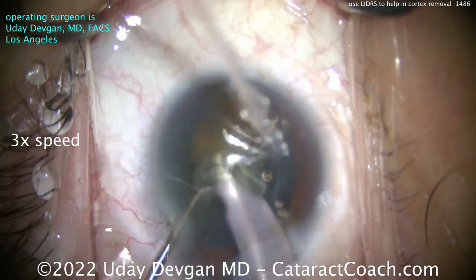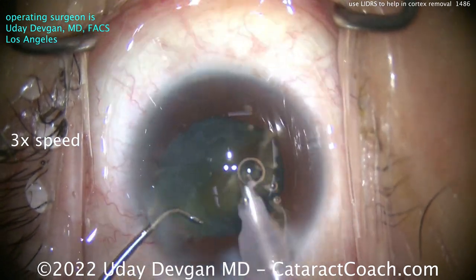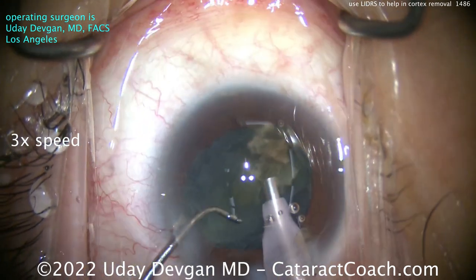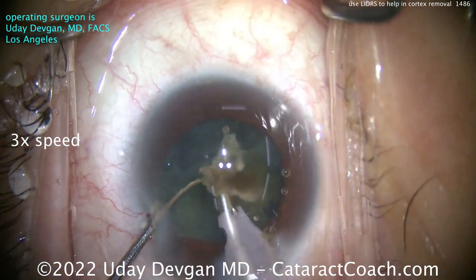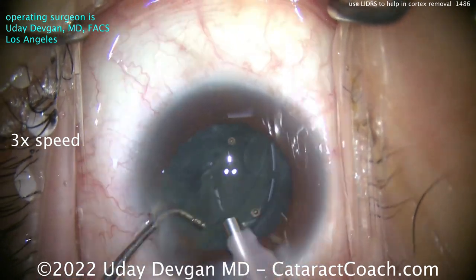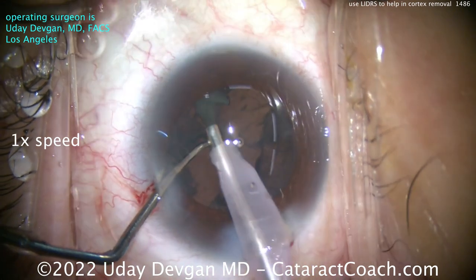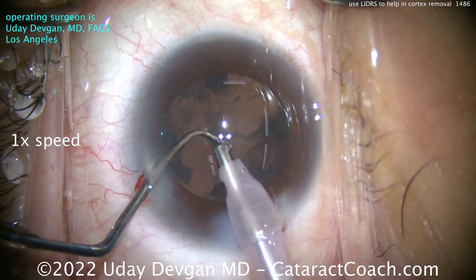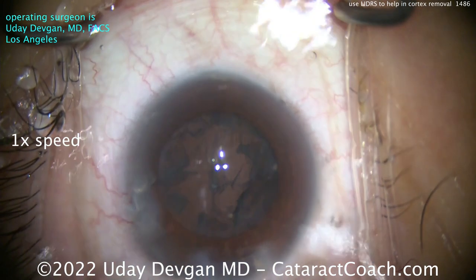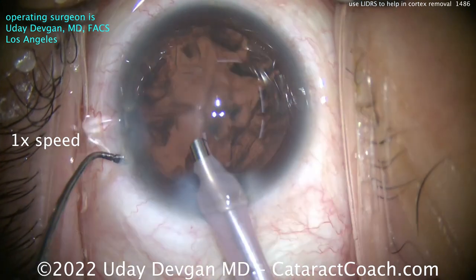Just taking our time, sub-chopping the pieces into smaller fragments, then emulsifying them down — that goes pretty well. This patient does not have the biggest pupil to begin with. After the nucleus is removed and we go for cortex removal, the pupil is on the smaller side and you're not able to see all of the capsule bag. We take out as much as we can of that lens material, the epinuclear shell — nucleus is already gone. Take a look at the pupil size: not the biggest.